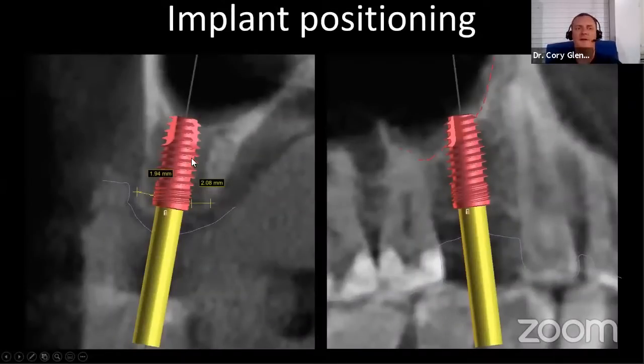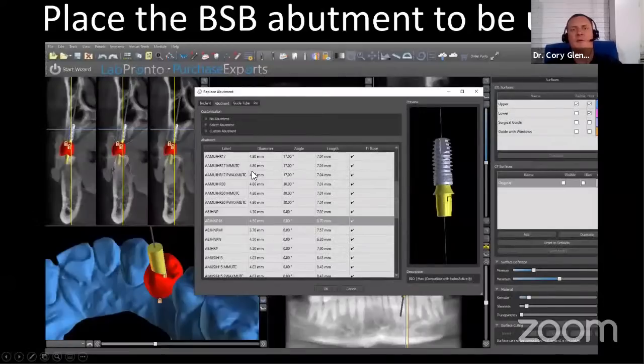But we're following the zero bone loss concepts. We've got a good couple of millimeters on each side of the implant of native bone because we want to. That's a really important aspect for the long term stability here. And now, even though we haven't even done this surgery, we've positioned the virtual implant, and we're going to do guided surgery, so we know it's going to end up there. So we could go ahead and make the final restoration and have it ready to deliver at the time of surgery. So it's the exact same workflow that I was just showing you for the tie-base crown.